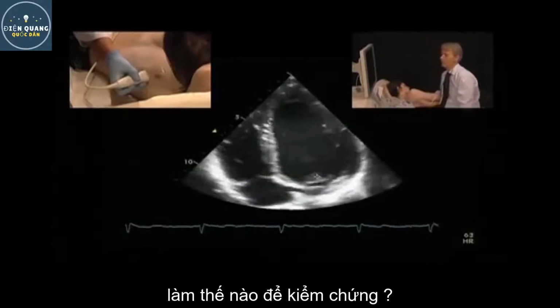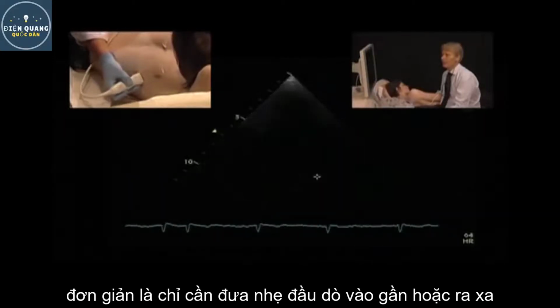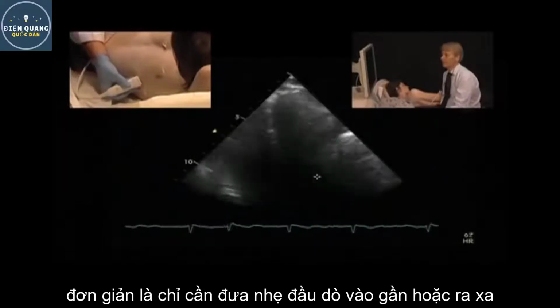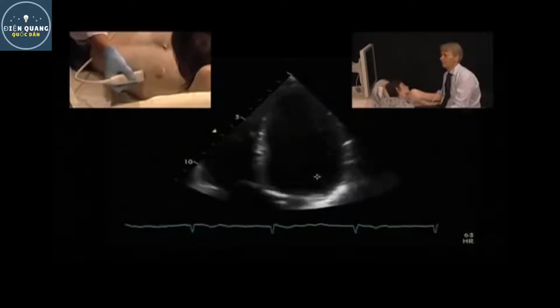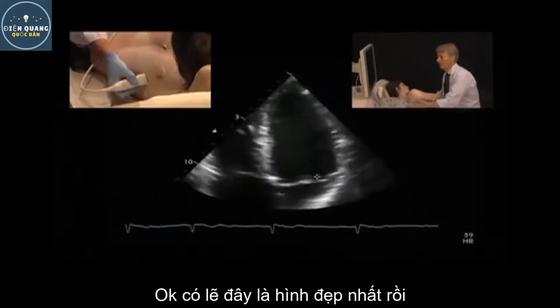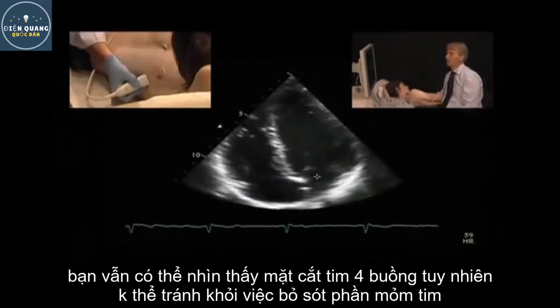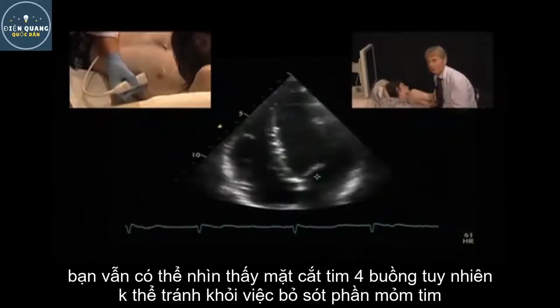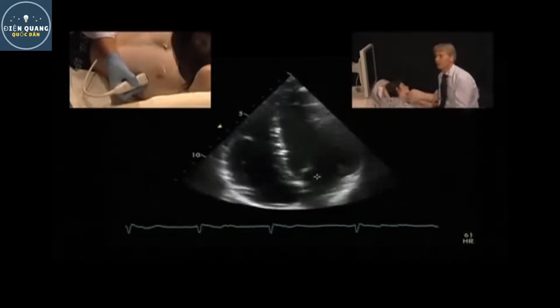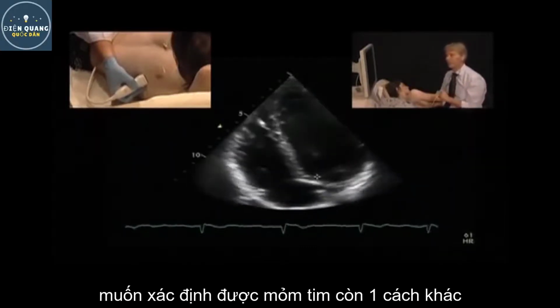How can you correct this? You can correct it by just moving more apically and laterally. Okay, this would probably be a better view. So this is much less foreshortening. Of course, you cannot avoid that you miss some of the superapical views, but this is certainly better than what you've seen before.